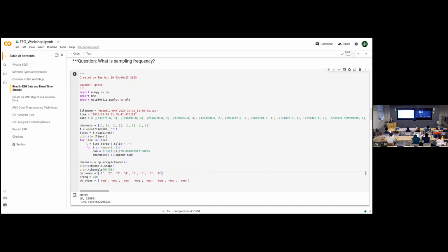It's essentially how smoothly you can differentiate from point to point in time. I think that's along the thought I was looking for. Do you have additional thoughts to add to that? I can tell you that hertz is in units of 1 per second. So if we say something like 250 hertz, what could that be? Like the raw definition of sampling frequency.